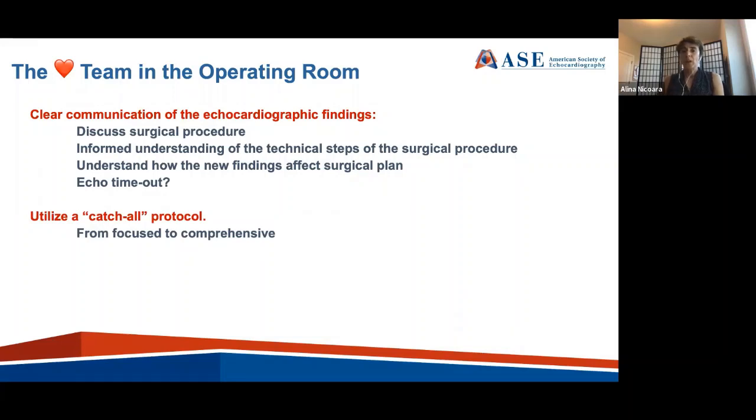It is important to utilize a catch-all protocol. This will allow you, even if you are focused at the beginning of your exam because you're trying to answer questions that the surgeon might have, which may affect the surgical plan, to ensure that you routinely perform a similar exam in a way that you look at all the structures and that you don't miss findings. So having a routine of using an imaging protocol over and over again is very important.